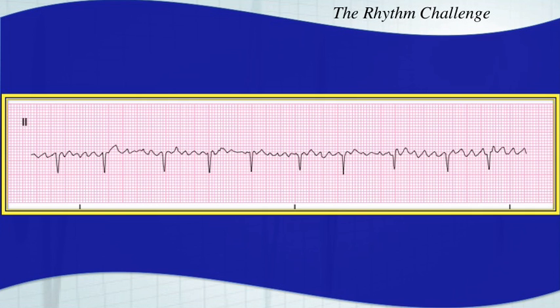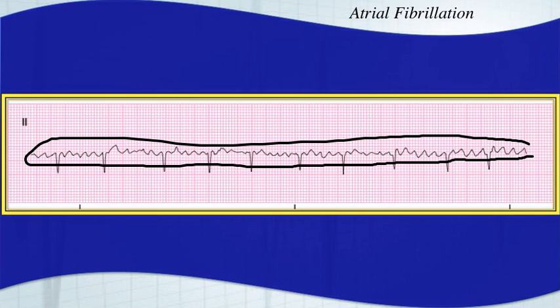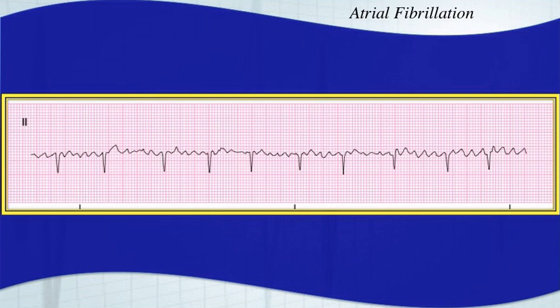Here's your first arrhythmia. Go ahead and look at the atrial activity, the ventricular activity, the width of the QRS complexes, and hit the pause button and try to give your best interpretation. This first arrhythmia is atrial fibrillation. You may have been thinking atrial flutter, but this is not a flutter wave pattern or a sawtooth pattern. This is a fibrillatory wave, and it is an irregularly irregular arrhythmia. If you look at these R-to-R intervals, they are definitely not consistent. With a fibrillatory wave, you're unable to identify any clear P waves.